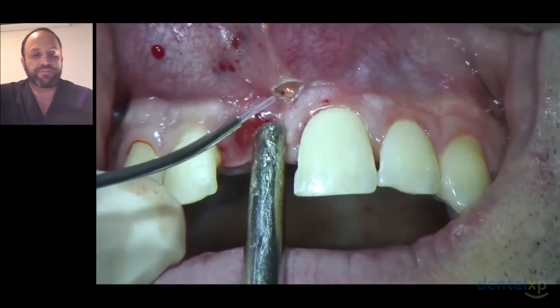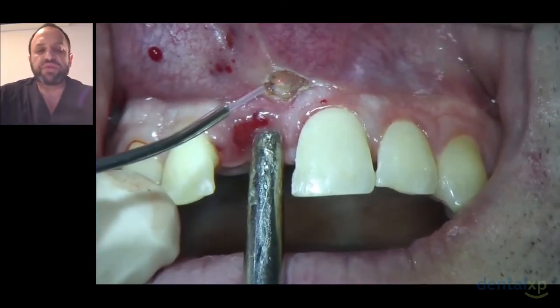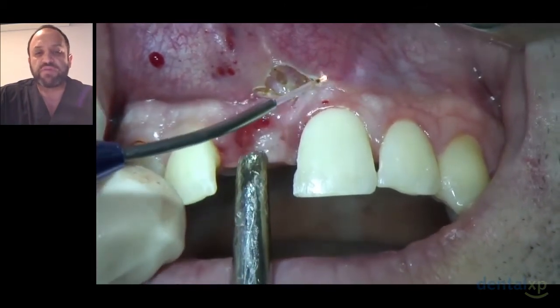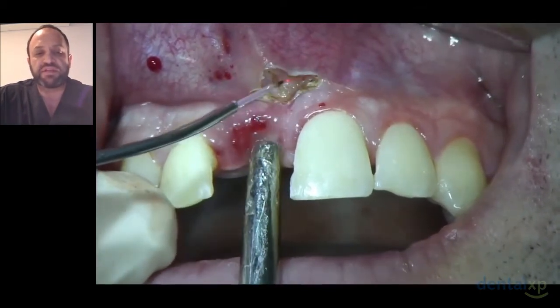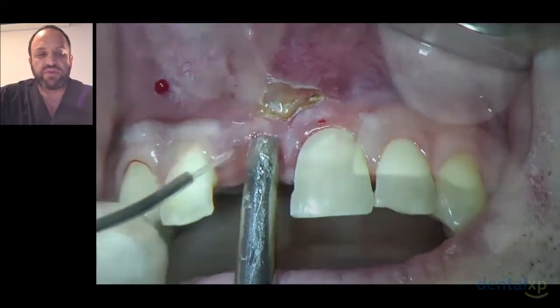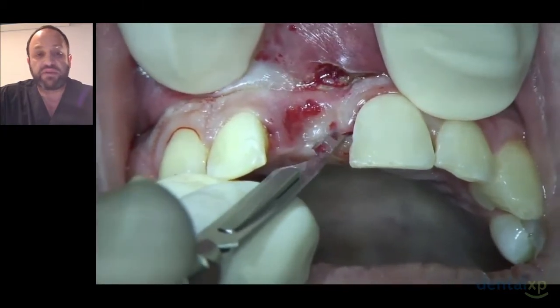2 months later, the scan shows extensive damage, and now we're going to carry on and do our bone augmentation. The first thing we've done in this case, as I do in a lot of my cases, is make sure that we're able to get tension-free closure, and that generally involves removal of the frenum if it is in that area. I like to use the laser. The laser is very quick, very easy, and bloodless. And here you can see just making a midline crestal incision.